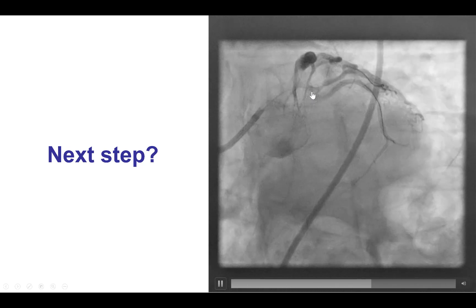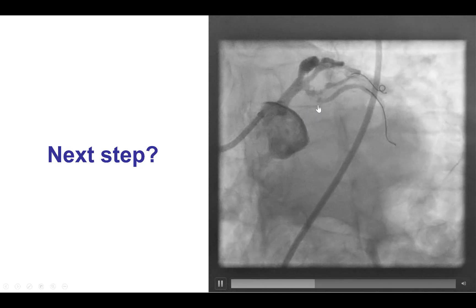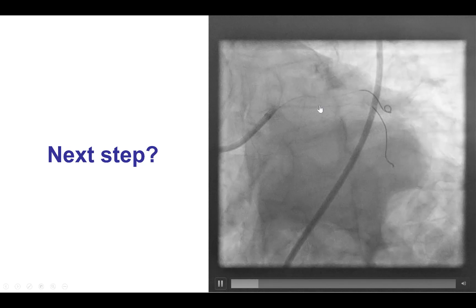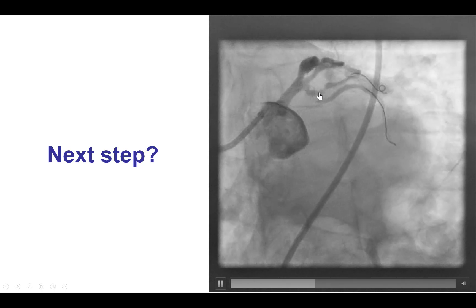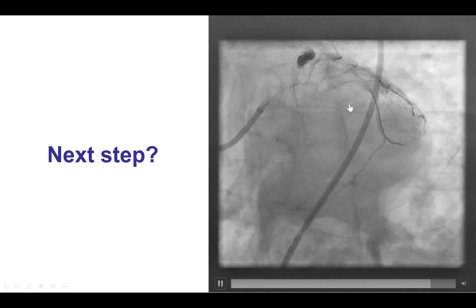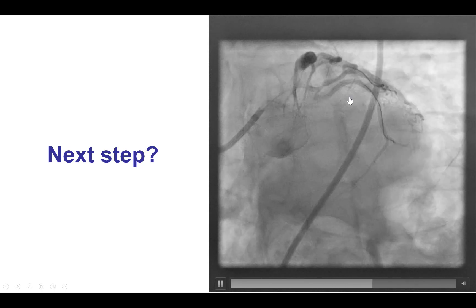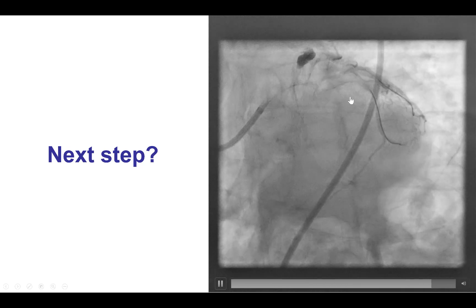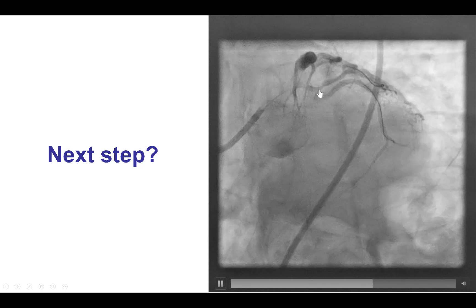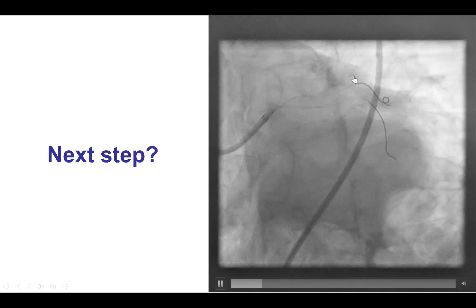So this effectively changes the bifurcation from a 011 to a 010, which means that a provisional stenting strategy is actually preferable for this lesion. This should be done after putting a stent more distally into the OM to treat that lesion.